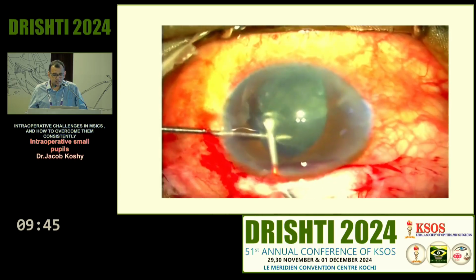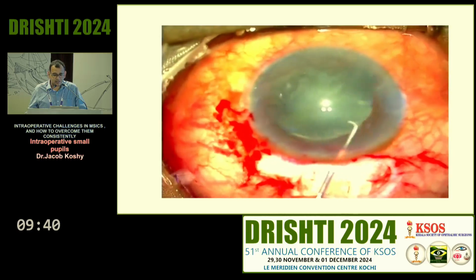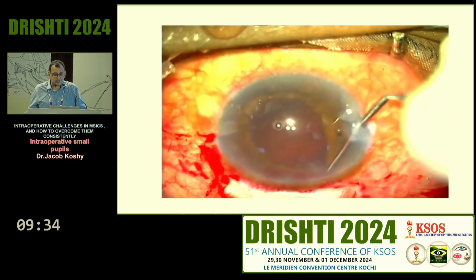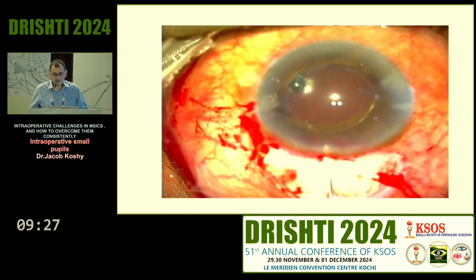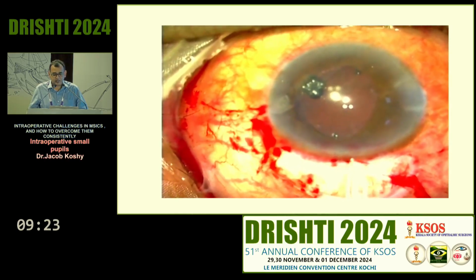Now, getting the nucleus out is the trickiest part. If you can manage without extending your subluxation, then you're good. Always keep checking to see if the other areas are okay and the extent of subluxation. Now here I decide to put a PMMA lens into the bag without a CTR, using the haptics to stretch the area of subluxation.